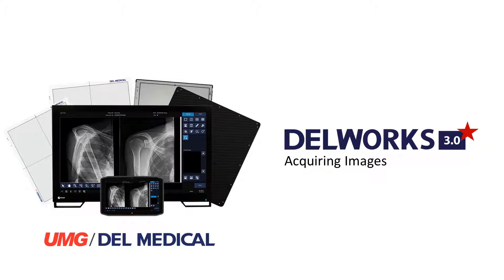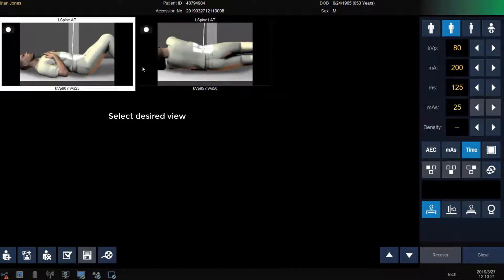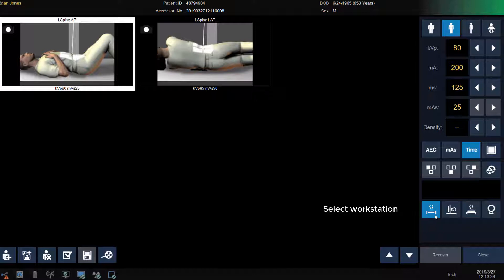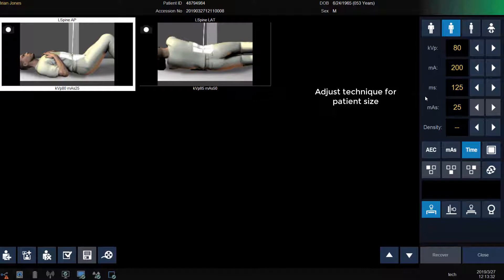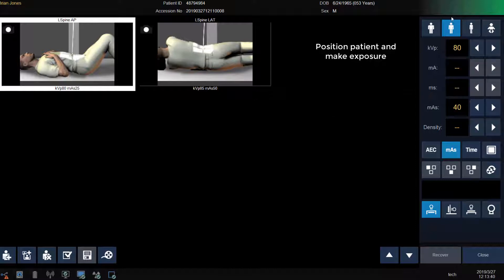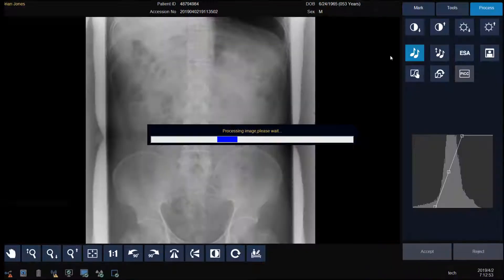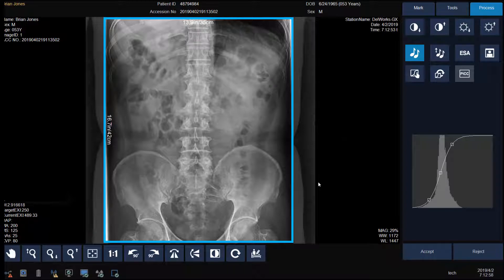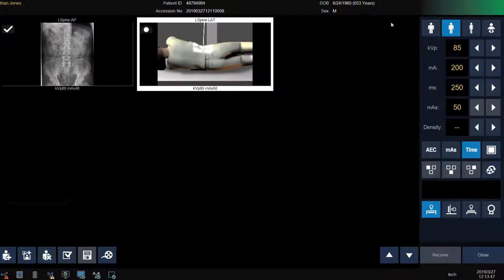Acquiring images from the acquisition screen. We can now click on the view we want to start with first. Verify or modify our workstation. Modify our generator settings if needed for patient size. Position our patient and make our exposure. After a few short seconds the image will be displayed. From here you can crop or annotate the image. If no changes are needed, click Accept or click Reject to repeat the image. After accepting the image, we return to the acquisition screen where we can select our next view and repeat the steps.